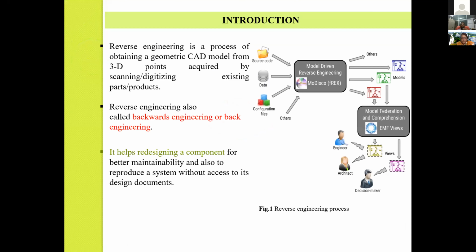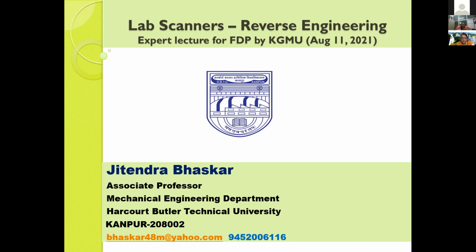So the part we have covered till now, in previous days, was various types of imaging techniques, intraoral scanners, and a little bit of extraoral scanners. Mostly things are oriented towards the dental area. But I look at all these scanning devices as a kind of reverse engineering.